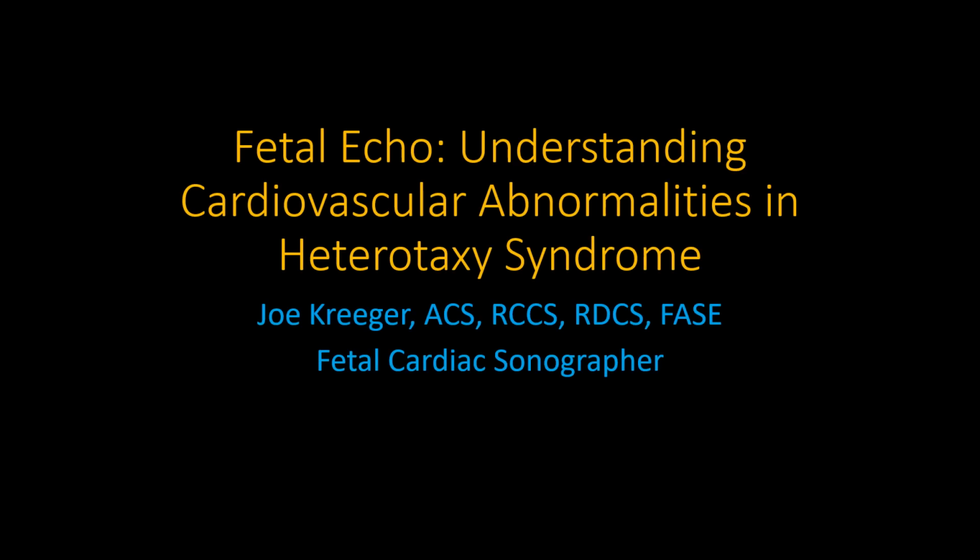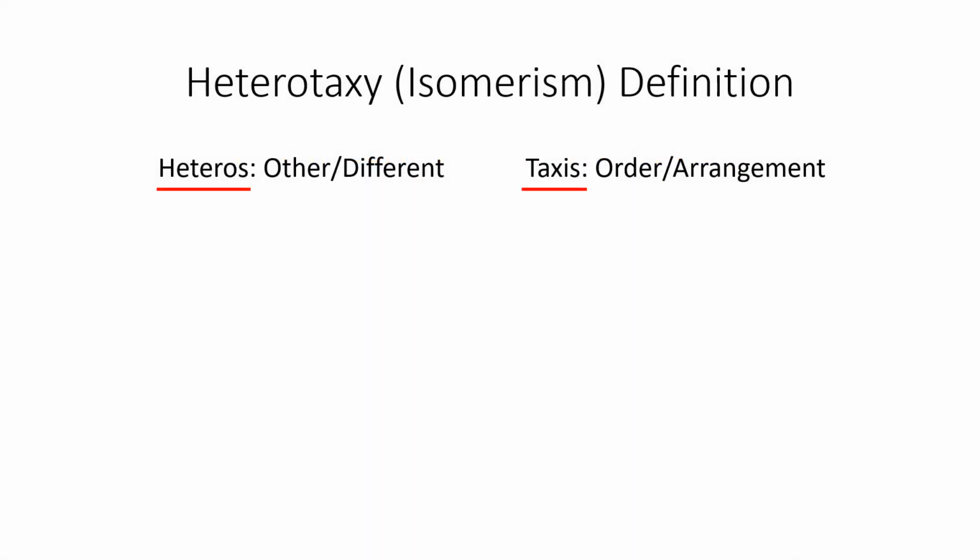During the lecture, I will highlight the features of heterotaxy syndrome and the criteria used to make the diagnosis with fetal echocardiography. Now, to start with, the word heterotaxy is derived from the Greek words heteros, meaning other or different, and taxis, meaning order of or arrangement.